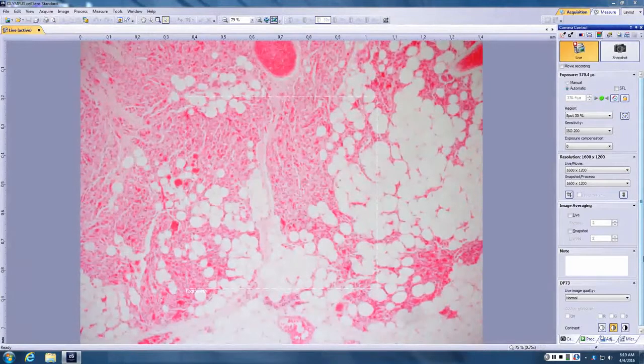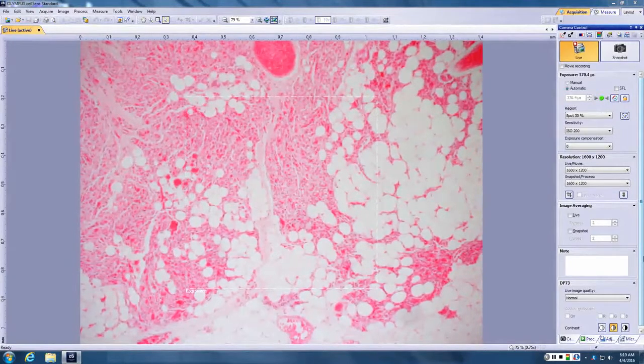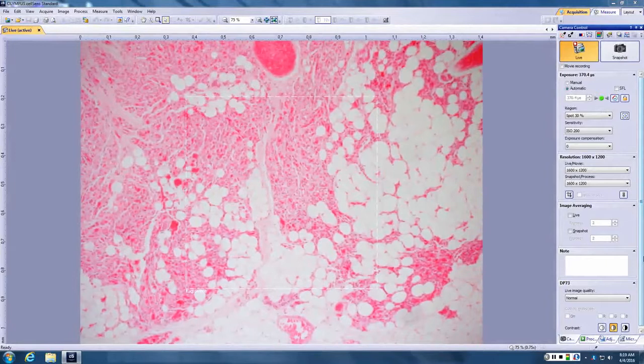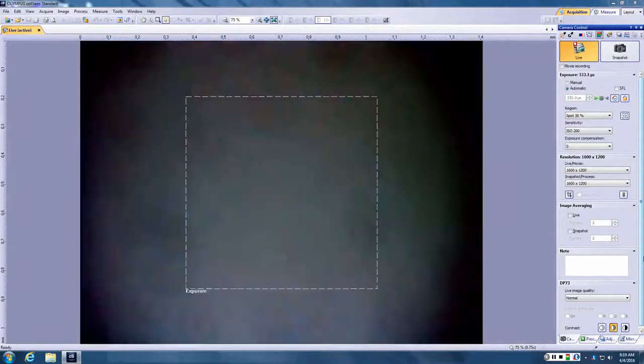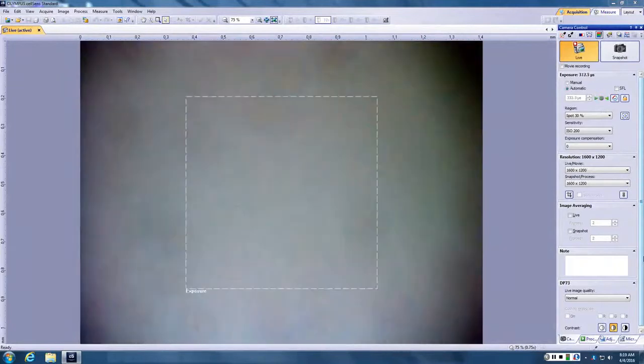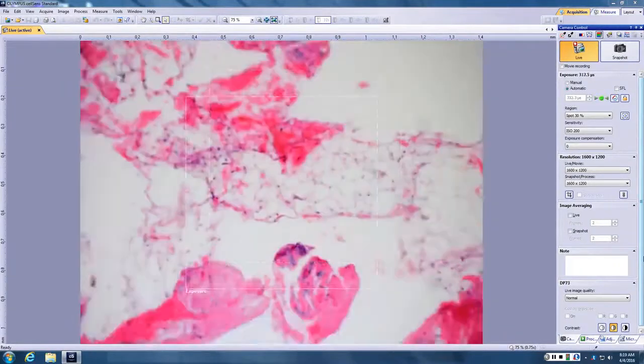And then you have these little chondrocytes. And is there a lot of pleomorphism and vacuolization like the chordoma had? They seem more regular. Yeah, yeah, like just a lump of cartilage that doesn't belong there. So what would you call an oma of chondrocytes? A chondroma, yes, exactly. So just a solitary chondroma or cutaneous cartilaginous tumor, you can use either term. So definitely fat, really vascular. Yeah, really vascular. So what would you call an angiolipoma? What's that? Yes. So angiomyolipoma, exactly right. Hold on.